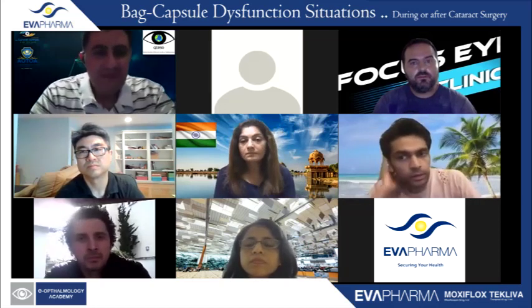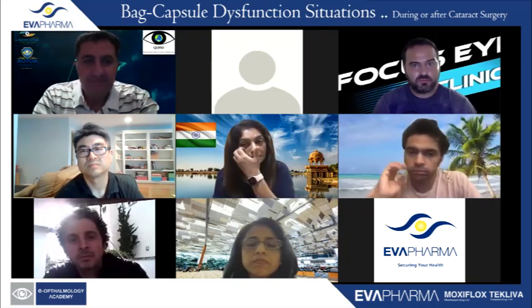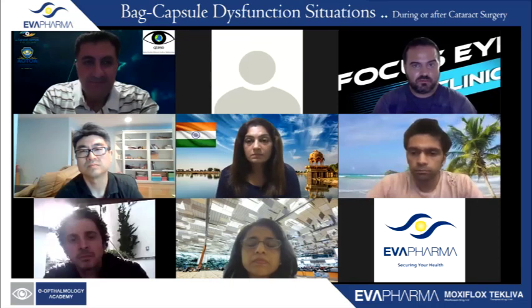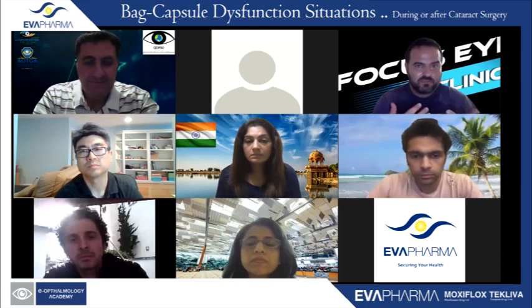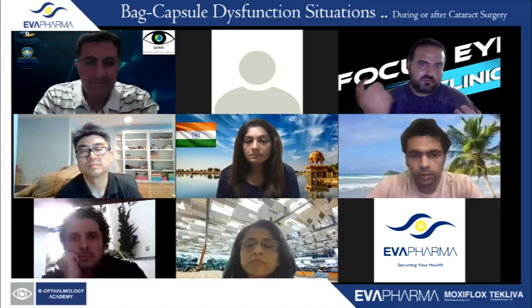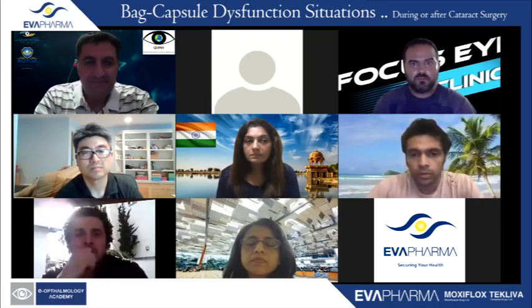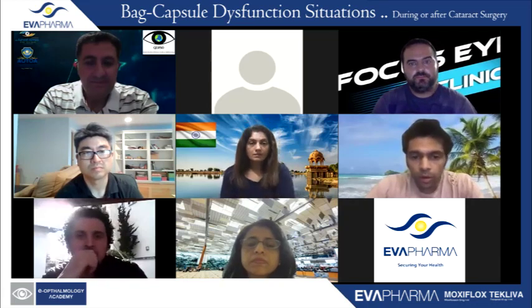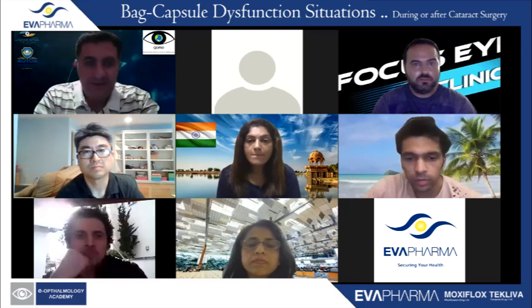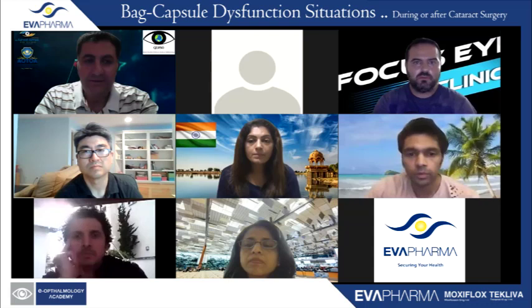Yeah, the only issue you can face is UGH syndrome, which I admit happens in about 1% of the cases. So you can choose that in elder patients when you judge the risks from the benefits. 1% is the chance to have UGH syndrome. And no need for peripheral iridectomy in single piece IOLs? Oh no, I do it in every case. Every case of iris fixation, peripheral iridectomy.